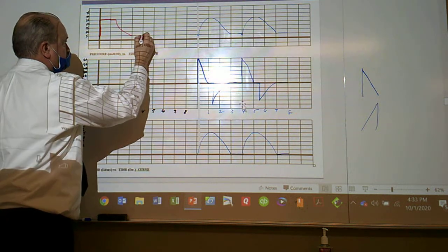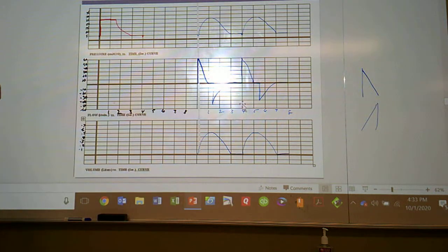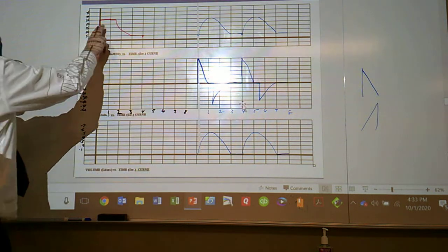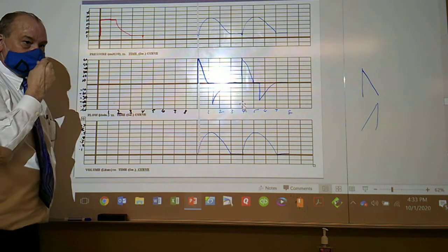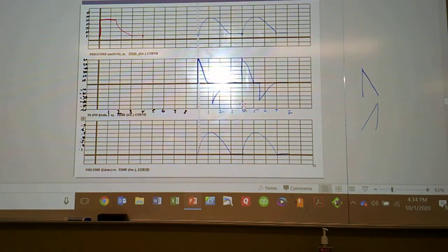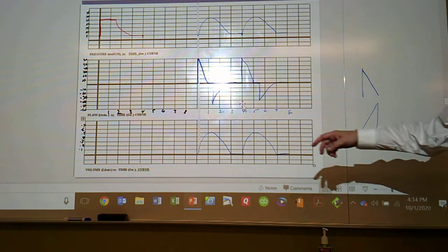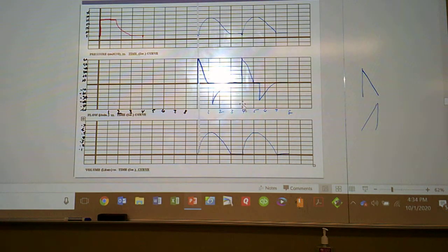How do we get that again? How far it is over the top part? That is like 1.5: 1 second inspiratory time and a half a second hold. Inspiratory time is 1 second. When do we have to do the total cycle time though? To figure out where the next breath starts. At a rate of 15, total cycle time is 4 seconds, and then the next breath has got to be given at 4 seconds.